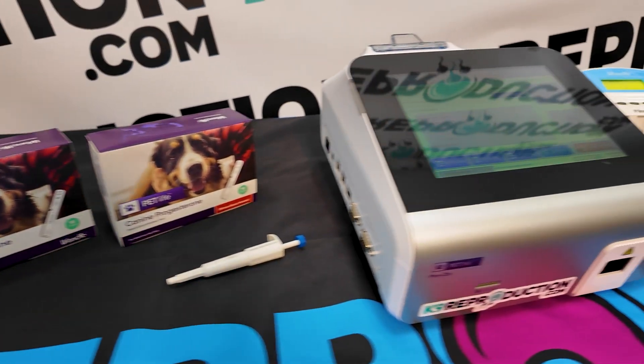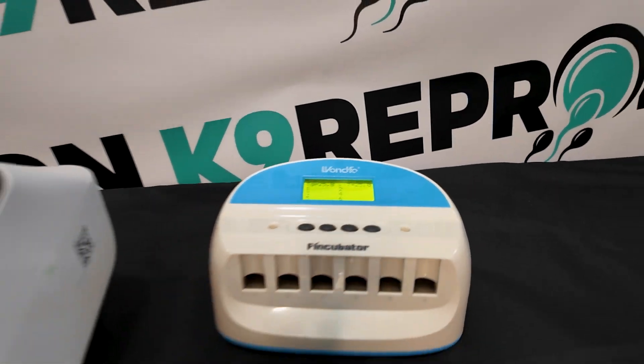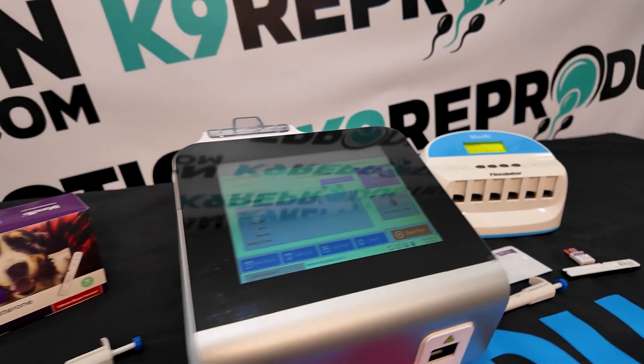Before starting the test, it's crucial to ensure all supplies, including the test strips and serum, are brought to room temperature. This step is essential for achieving reliable results.